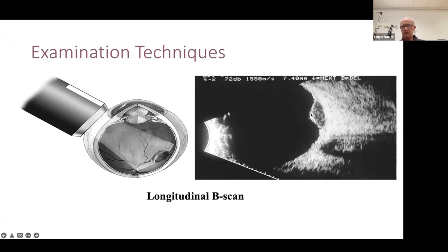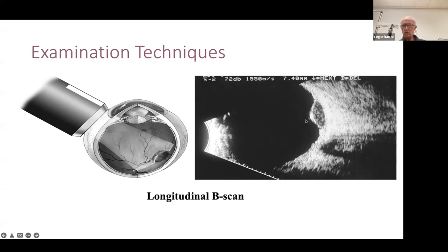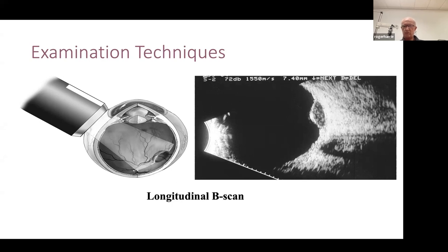Here is the longitudinal position of the same lesion — the dimensions are a little different. When you want to characterize a lesion, you want to characterize it both in horizontal and vertical directions. That's important for size: if you had a really elliptically shaped lesion and just measured in one dimension, you'd get a falsely low reading compared to the other dimension. Those two together are how you characterize a lesion. Also, when treating with plaques — a radioactive iodine plaque sewn to the back of the eye for three to five days to kill the tumor — you need to know those dimensions.